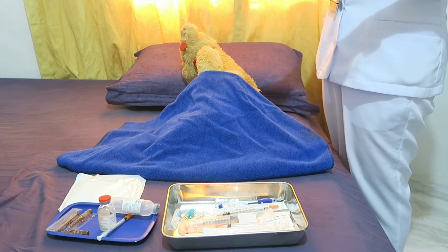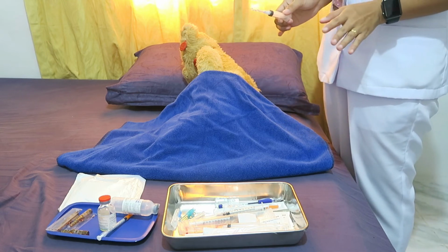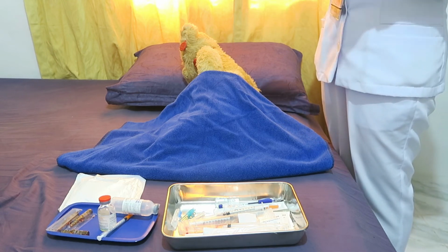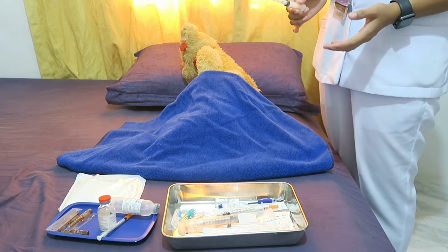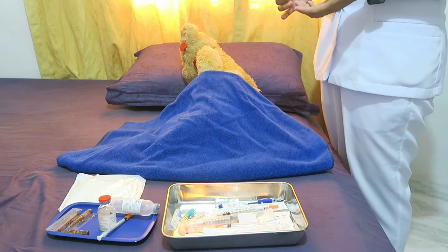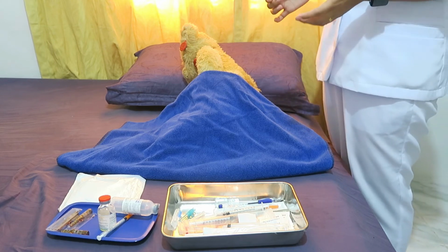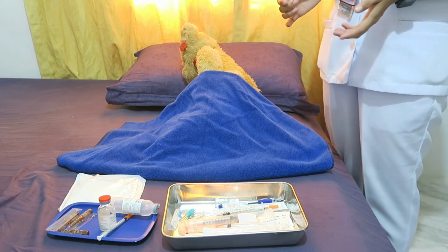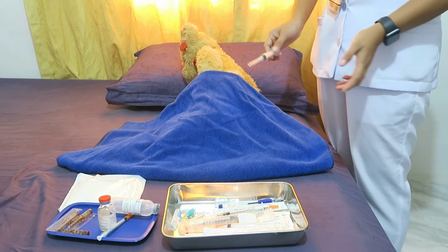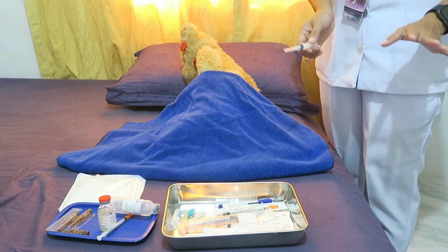After that, the procedure is to hold the barrel of the syringe steady with your non-dominant hand and aspirate by pulling back on the plunger with your dominant hand. Aspirate for 5 to 10 seconds. The rationale for that is that using a quick motion lessens the client's discomfort. So, after that procedure, let's proceed to the next.